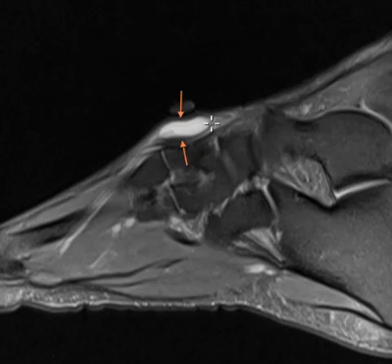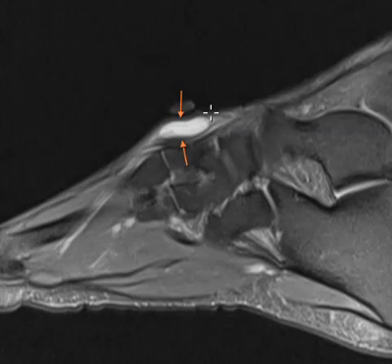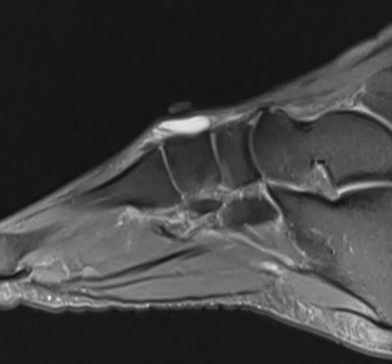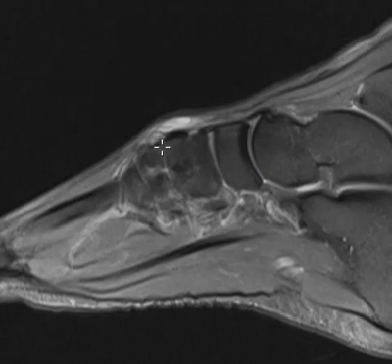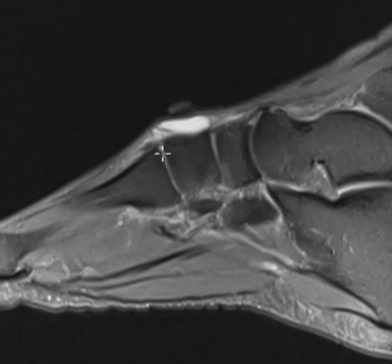I put arrows here. They're little fluid pockets — fluid is white on this sequence — and it looks like this one comes out of this joint. A lot of times they come out of a joint and they'll drape over a bone like this.